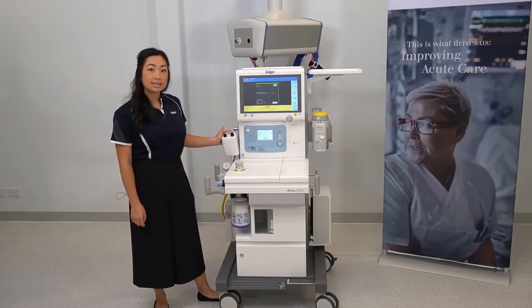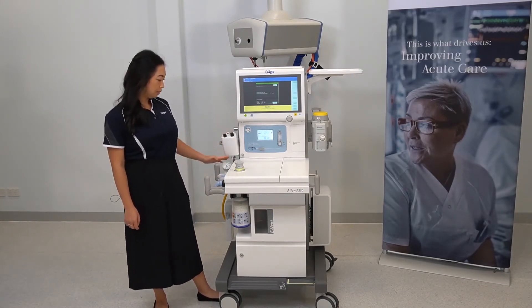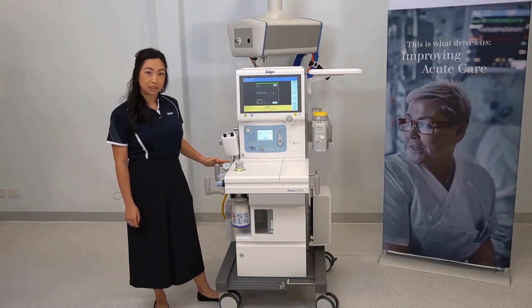To the side, this is the integrated suction device that may come on your device. Here is a manual pressure gauge.